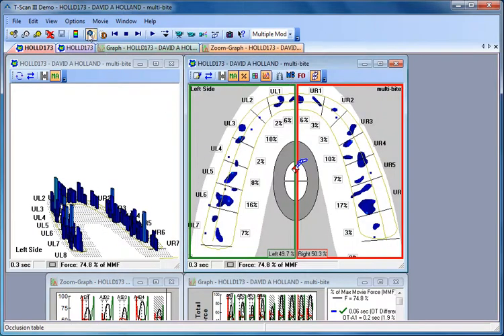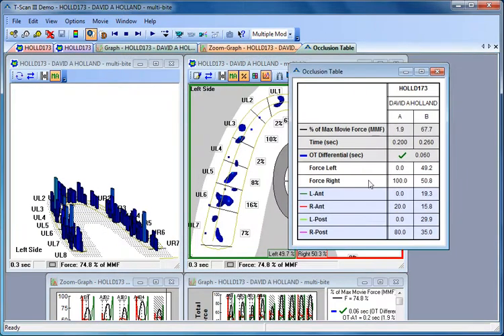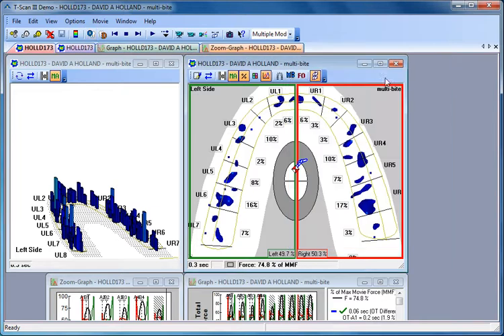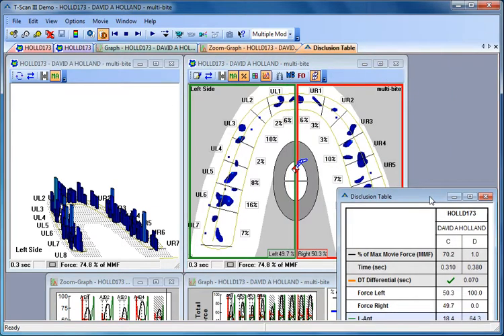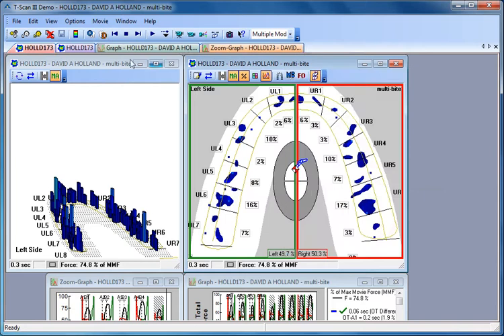So that's still there, and obviously the occlusion time information is still there. It's not relevant because this is just a multibyte table, but the disclusion time table is still available to us.